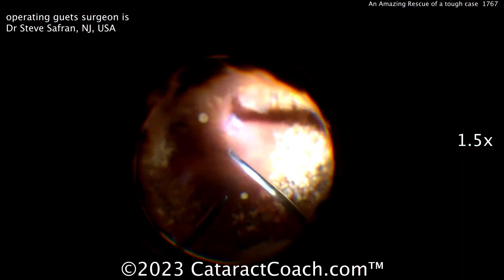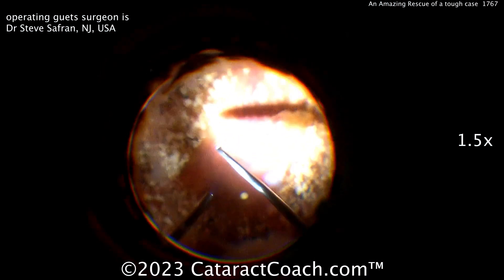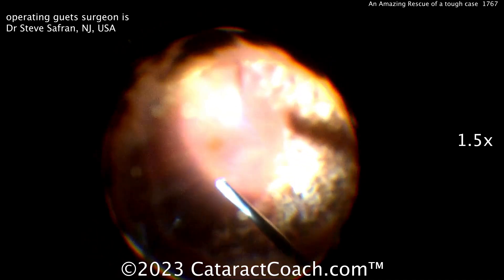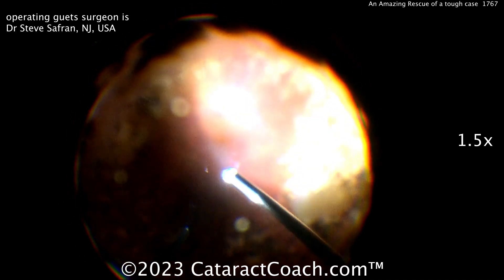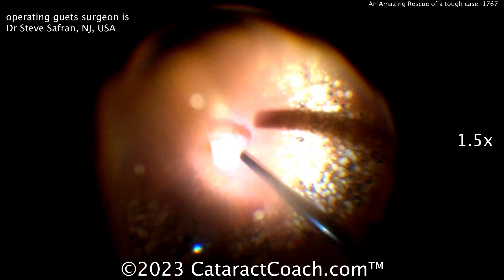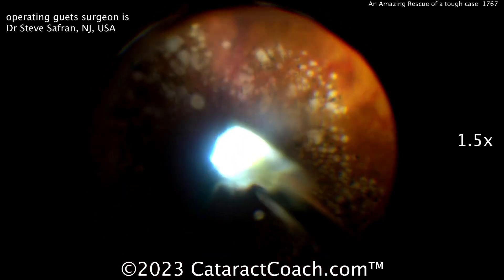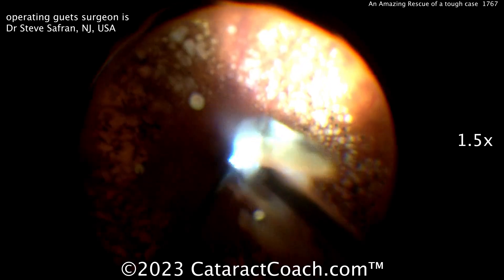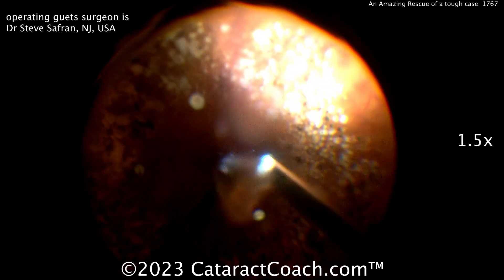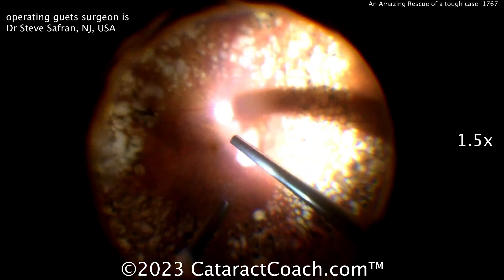You also have to take your time on this. If you're very fast on the vitrector, or the phacofragmatome, what's going to happen is you'll chase the pieces off the tip. You can use the vitrector and then go to the bigger phacofrag — aspirate those pieces, bring them up to your tip. There's the phacofrag now, the bigger needle, just a little bit of energy at a time and the pieces will come down pretty nicely. Before doing the phacofragmatome, you want to really aspirate out as much vitreous as you can and clean up the remaining posterior segment.